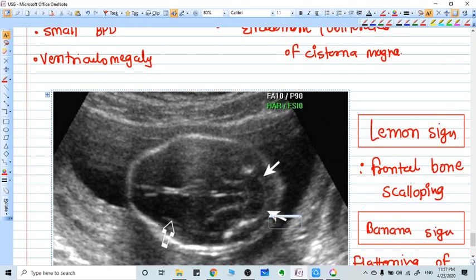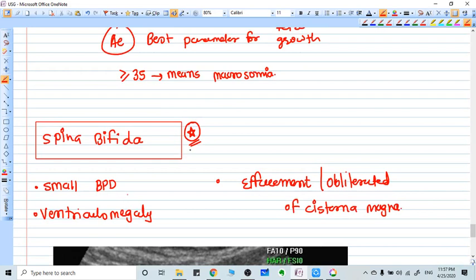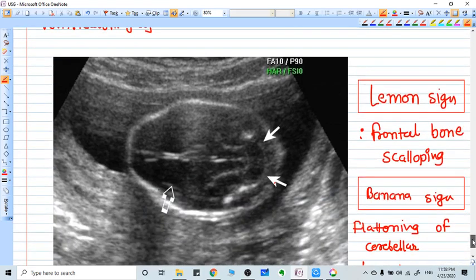In this video we are going to see spina bifida on ultrasound. This ultrasound image shows the thalamic view of the head. Spina bifida is a very common congenital condition in which a small biparietal diameter is present, there is ventriculomegaly, and effacement or obliteration of the cisterna magna.